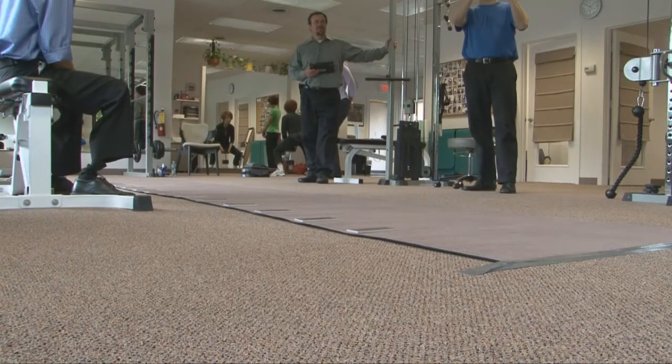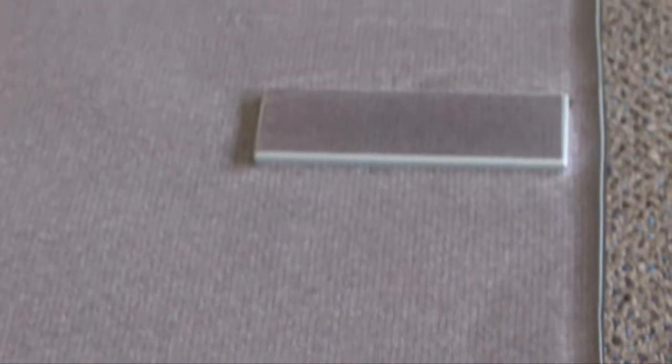The GaitRite is a portable electronic walkway. It measures temporal spatial gait parameters. So essentially, if you can imagine somebody walking down a beach and the footprints are recorded in the sand, the GaitRite has a series of sensors in the mat that detect whatever lands on it.